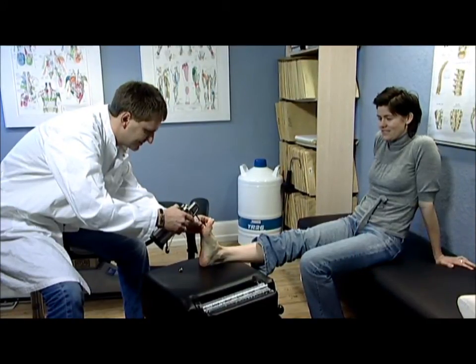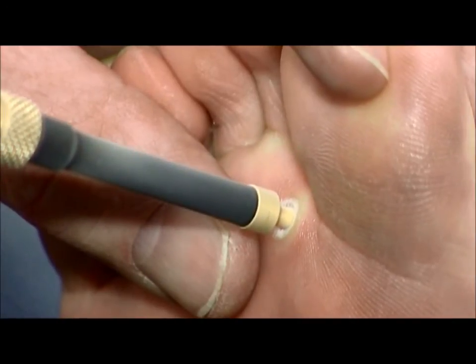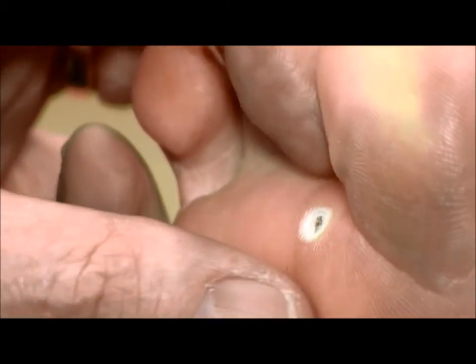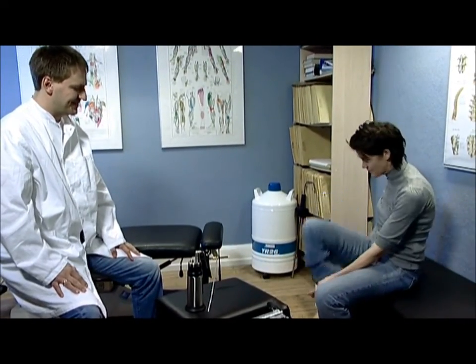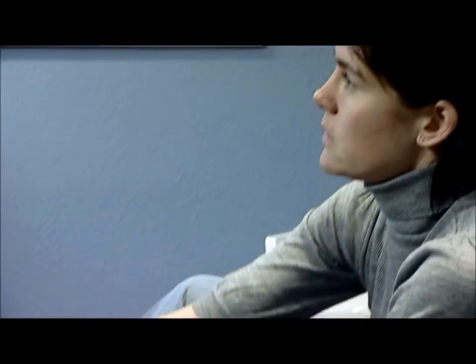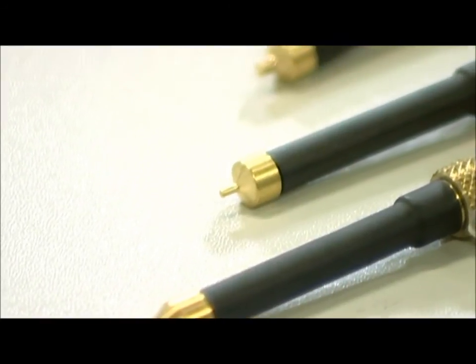Release the trigger and the probe will come off in a few seconds. This method ensures the quick freeze, slow thaw leading to optimal tissue destruction. Contact freezing offers a deep freeze with minimal lateral spreading. The freezing time depends on the type of lesion and the operator's personal preferences, but 10 to 15 seconds of continuous freezing covers a broad spectrum of applications. Guidelines regarding freezing times and choice of spray or contact freezing can be found in the enclosed manual or in relevant literature.